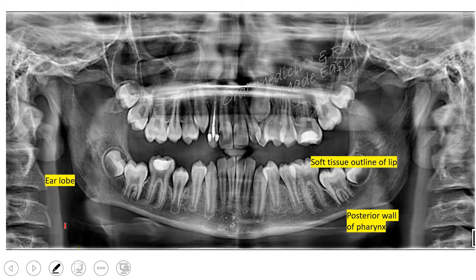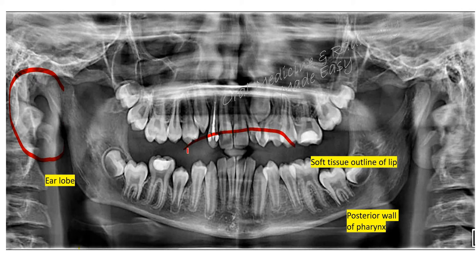In this radiograph we can see the earlobe. We can also see at the center the shadow of the lip, and this is the mouth opening used to hold the bite. This is the posterior wall of the pharynx, which is evident on both sides.